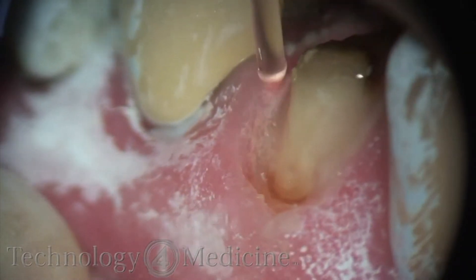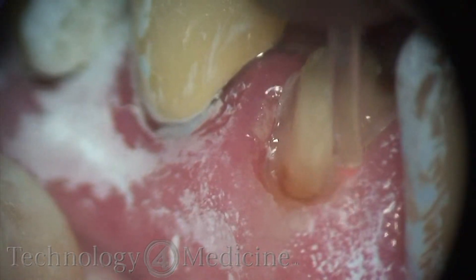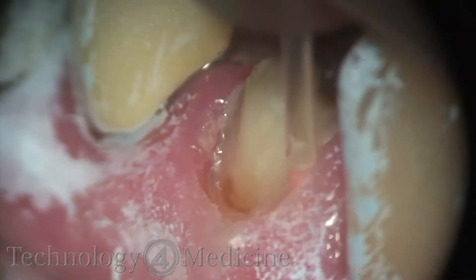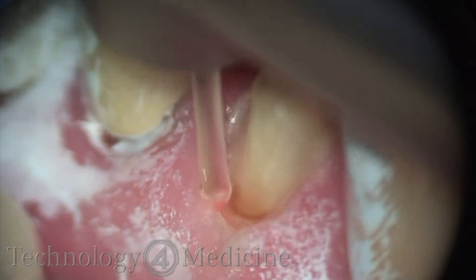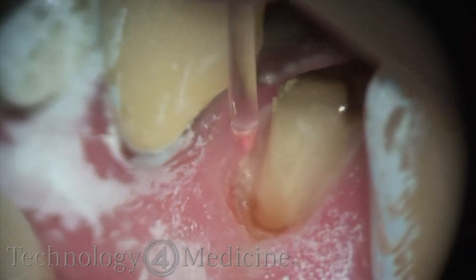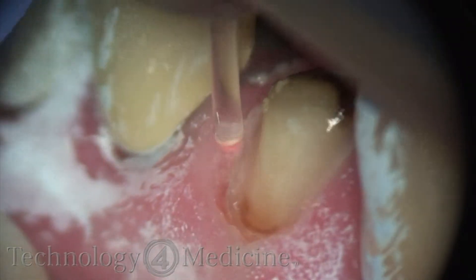I had removed a porcelain fused to metal crown that was previously placed on this tooth, and I needed to remove some tissue without removing tissue height — just to expose the margin. I'm performing this crown preparation for a CEREC. You can see CEREC powder and spray on the adjacent tissue and teeth.